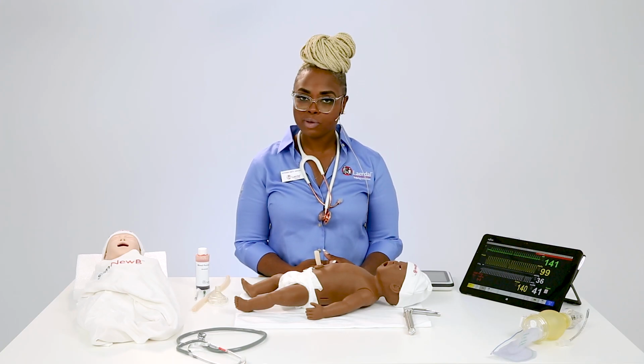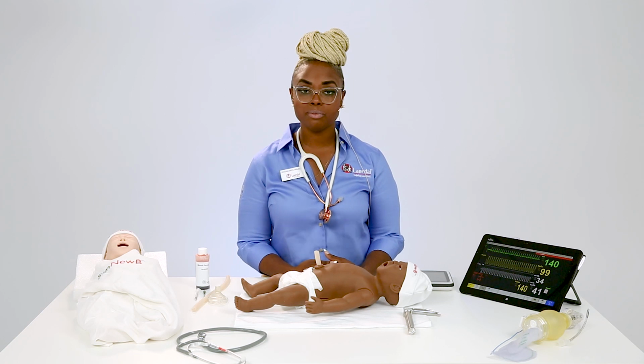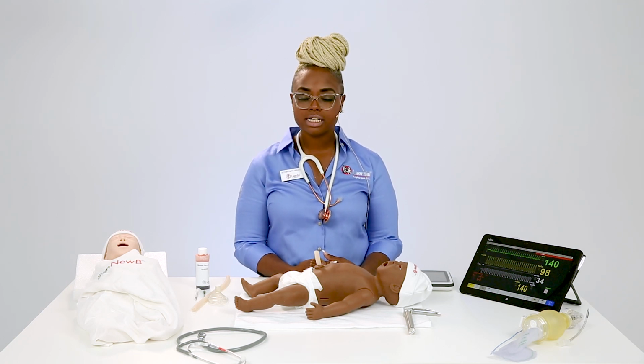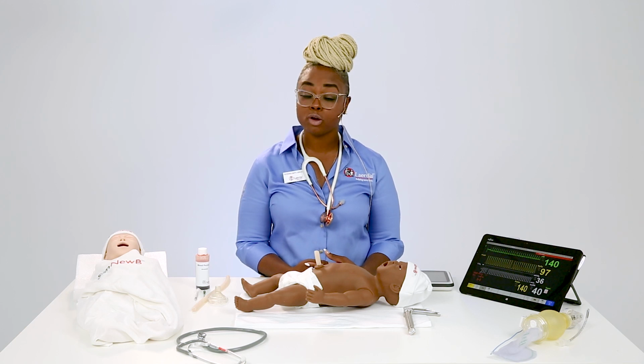That's great. Next question is about the sound. I know you talked about some of the sounds that are available already pre-recorded, but they were asking if sounds can also be recorded. Absolutely. I have a happy, cute baby at home myself, and some of those sounds I would love to incorporate into simulation. You are able to use the LEAP interface and the sound recorder to record some infant sounds that are different than the ones that are pre-programmed.